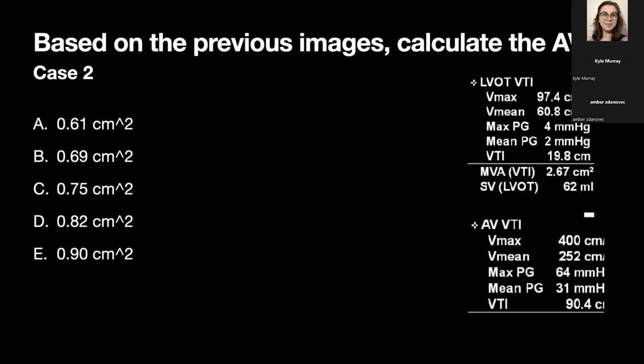Oh, I know. I know. This is the last calculation. All right, so what do we have? What do we get? B.